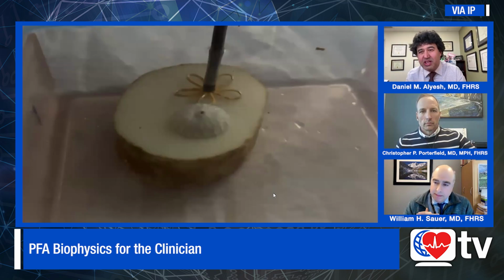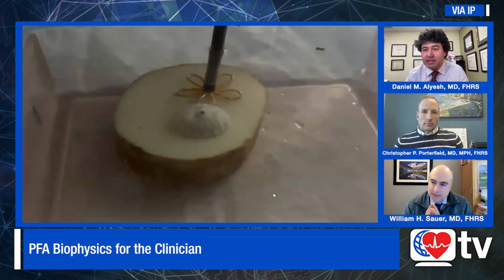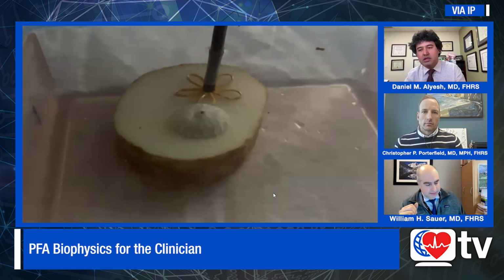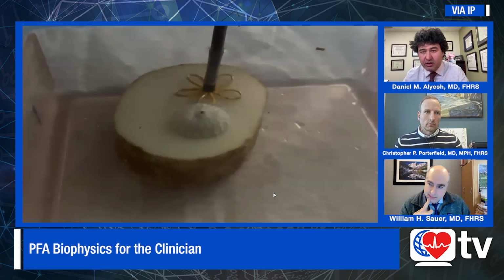Well, thank you for that. You sent me this video shortly after I did a PFA in a Watchman patient. My understanding, in my discussions with the company, was that if it's endothelialized, you're going to be okay. They don't recommend doing it within the 3 months, and I absolutely did not do that. I was watching on ICE and definitely did not see this effect. I think it's the 303 error, the metal contact alert that disables the PFA, and those safety mechanisms are very helpful. But again, a very interesting figure and an interesting space to continue to learn more in.